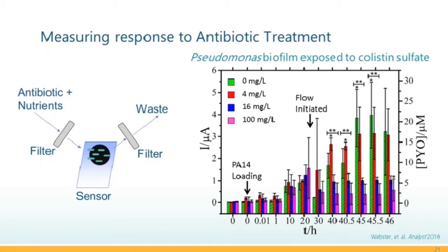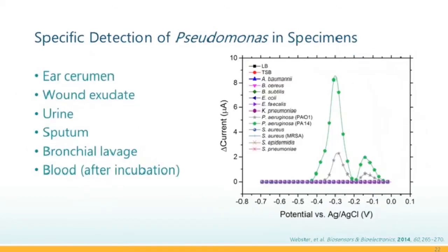infection diagnostics this way. The other key to this technology is being able to detect these QSMs directly in a biological sample without any sample preparation.